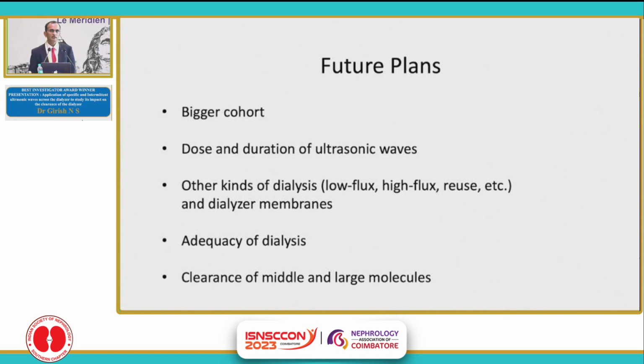So going forward, we look to expand the study on a bigger cohort, look at increasing the dose and duration of this ultrasonic therapy, and also try to use it on other membranes, low flux, high flux, etc. However, just of note, we started this ultrasonic therapy on reuse, because in most of our units we have a reuse policy. But then we found very variable results, especially after the second or third reuse, because their starting clearance values are totally abnormal. So we look forward to suggestions and ideas before proceeding any further with this.